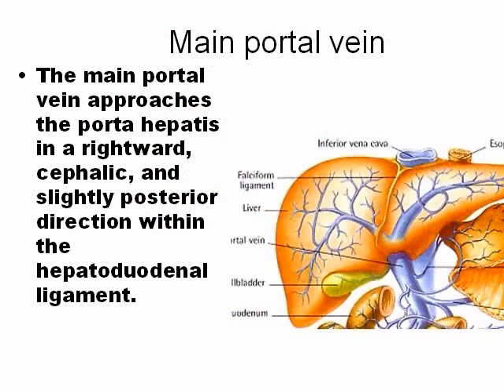The main portal vein approaches the portal hepatis. Remember, the portal hepatis is the hilum of the liver — the part where the portal vein, the hepatic artery, and also the bile ducts enter. It is near the gallbladder and is formed by the portal vein, the hepatic artery, and the bile ducts, and is inside the hepatoduodenal ligament.